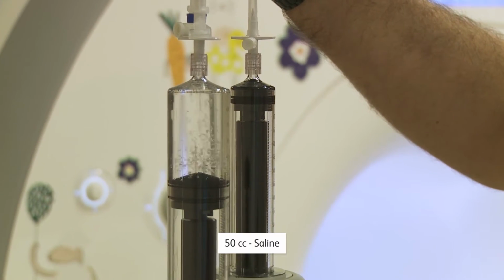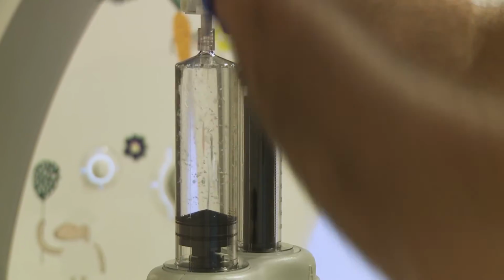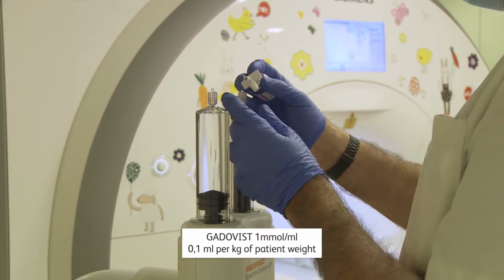The injection pump syringes are filled in with saline and gadolinium contrast media, and safety checks are performed to remove air.